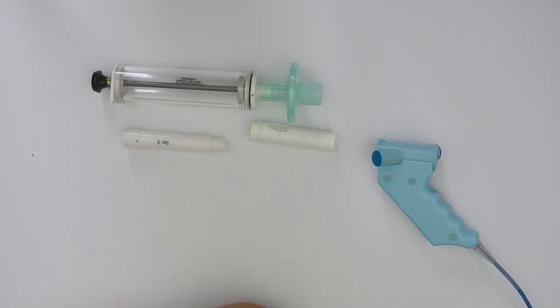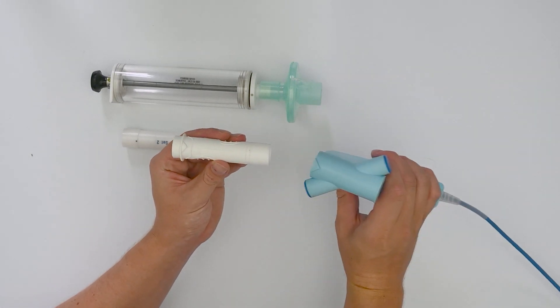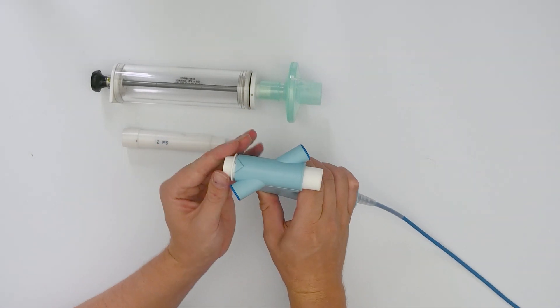Insert a spirette into the flow head. The triangle on the spirette should be aligned with the triangle on the flow head.